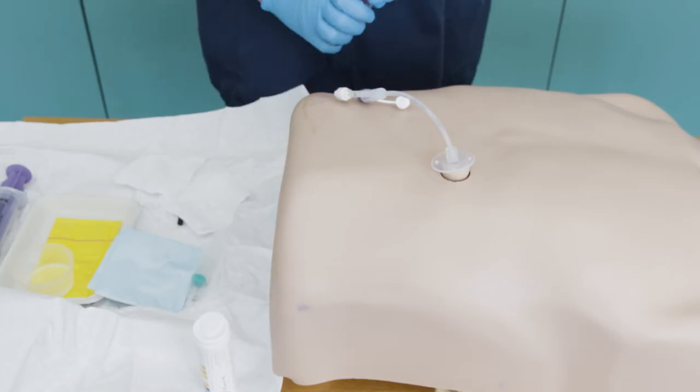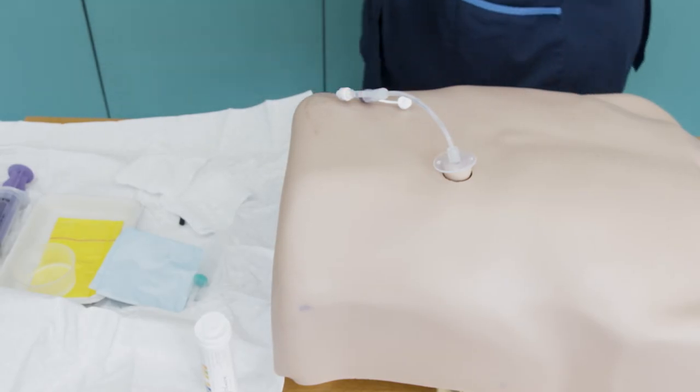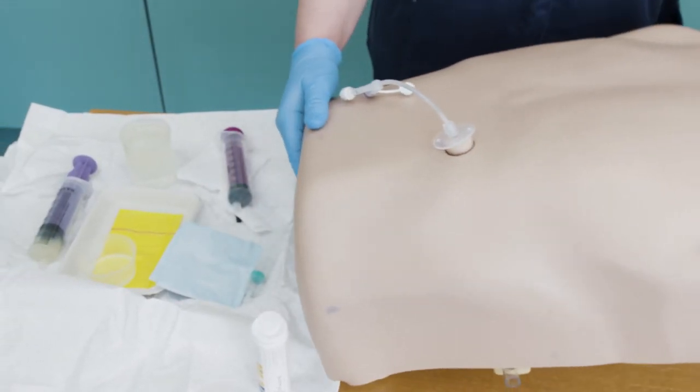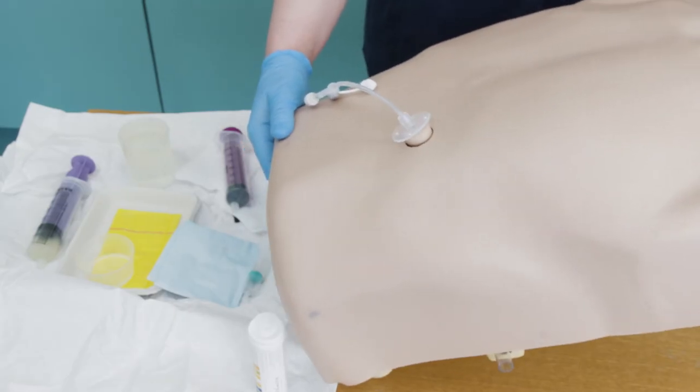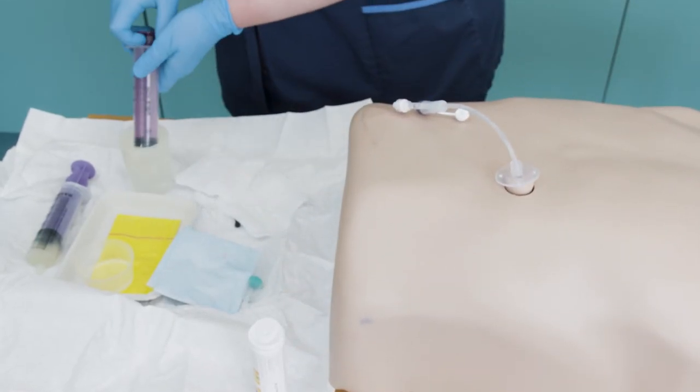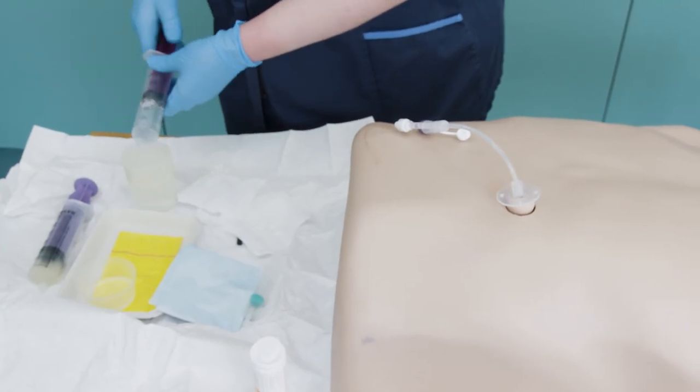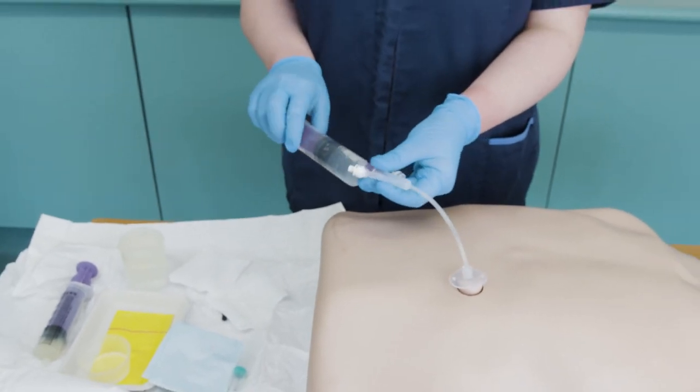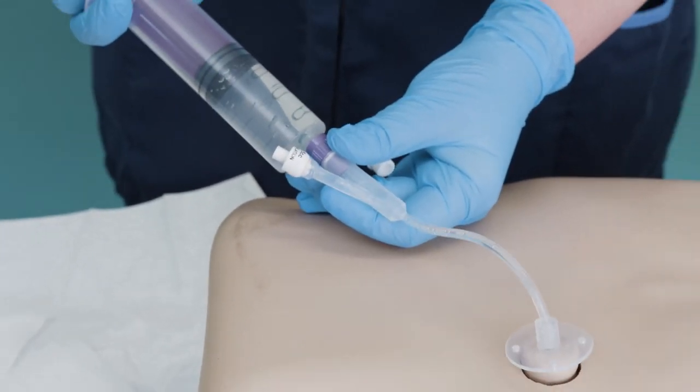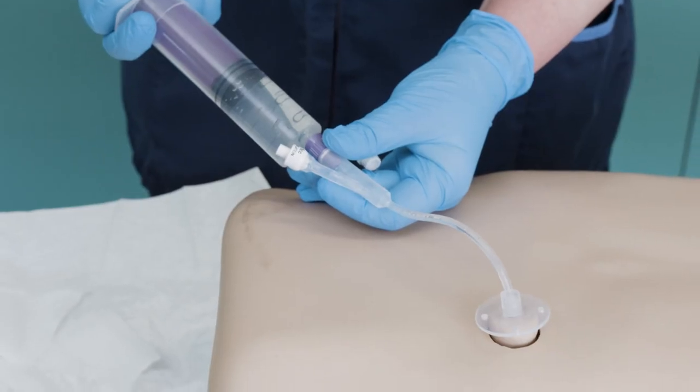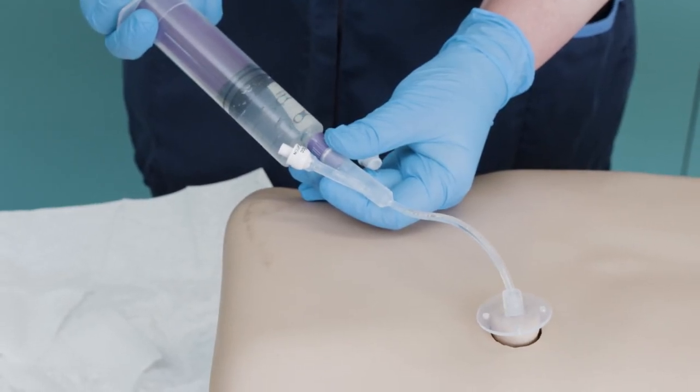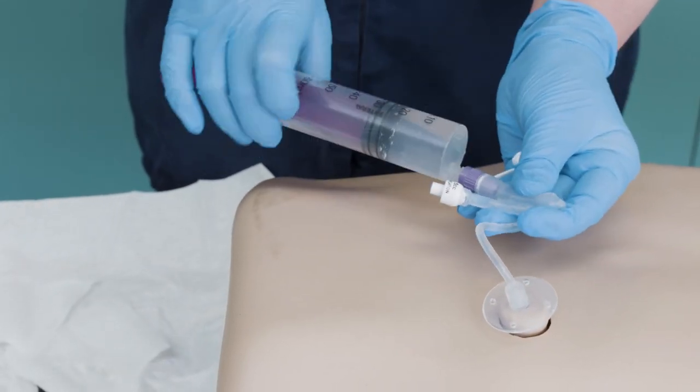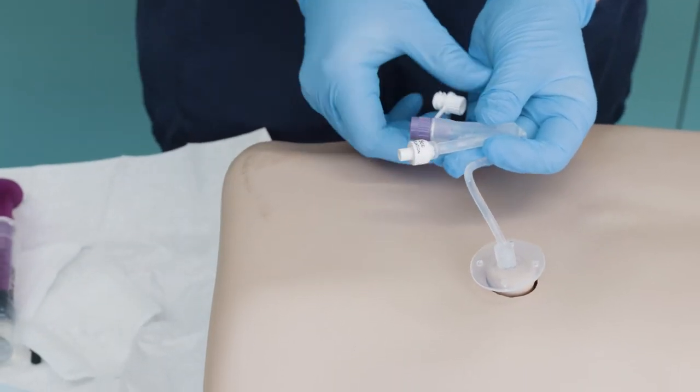Ensure the patient is now correctly positioned at a 30 degree angle or more upright, and then flush the tube with water. Note if the patient complains of any pain or discomfort, there is any resistance or leakage from the stoma site, and take appropriate action. The patient must remain in an upright position for at least one hour after the tube has been flushed.